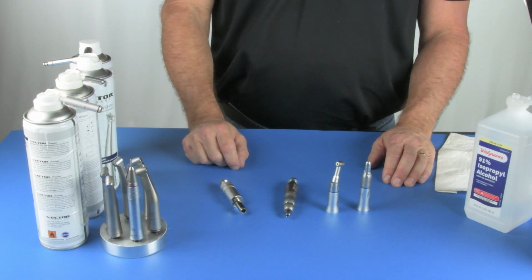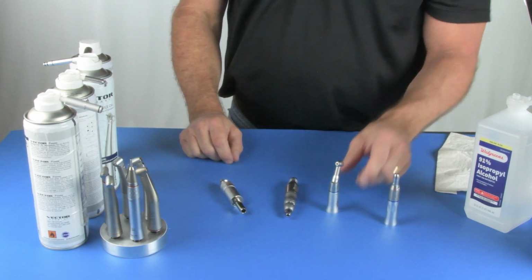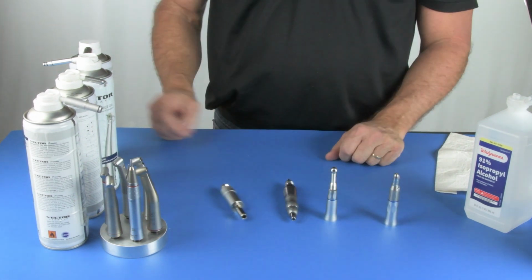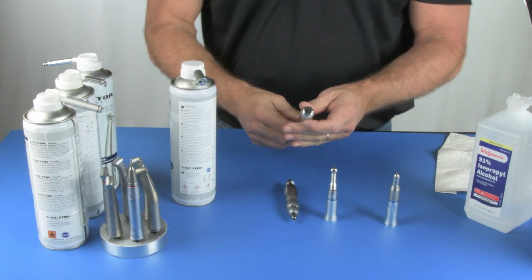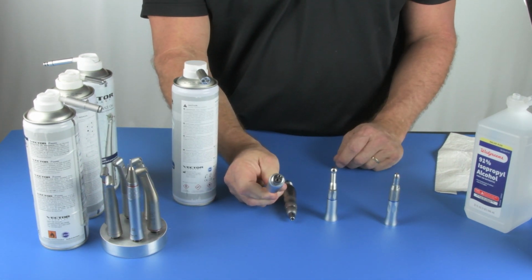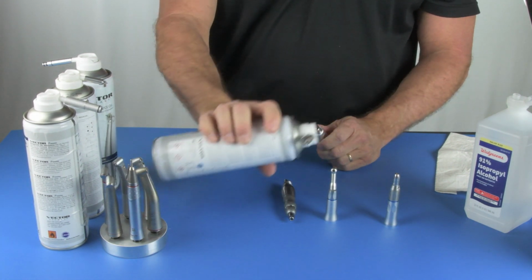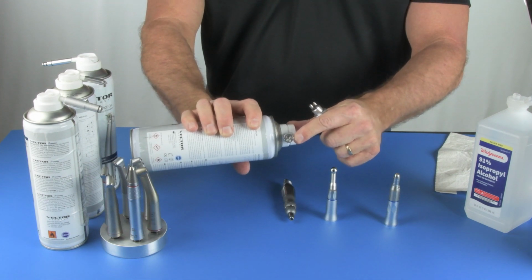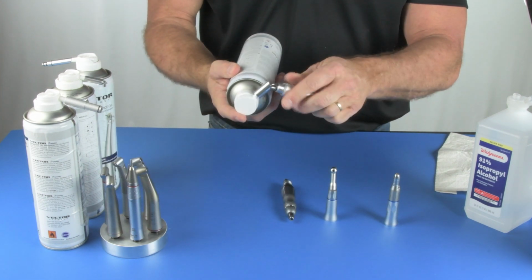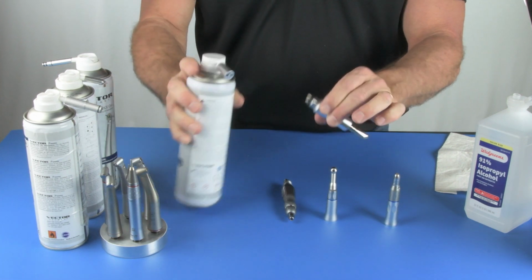All right, moving along, we're going to show you how to lubricate most low-speed handpieces, including hygiene handpieces. This also starts out with making sure that you have the right connectors for the different types of handpieces that are out there. Most low-speed motors are going to have a similar back end like this one. It's called a 4-hole back end. You want to use the correct adapter that already has the holes pre-drilled in it so you cannot mistake how you lubricate the handpiece. That is the absolute easiest way to line up, spray, and lubricate the handpiece.